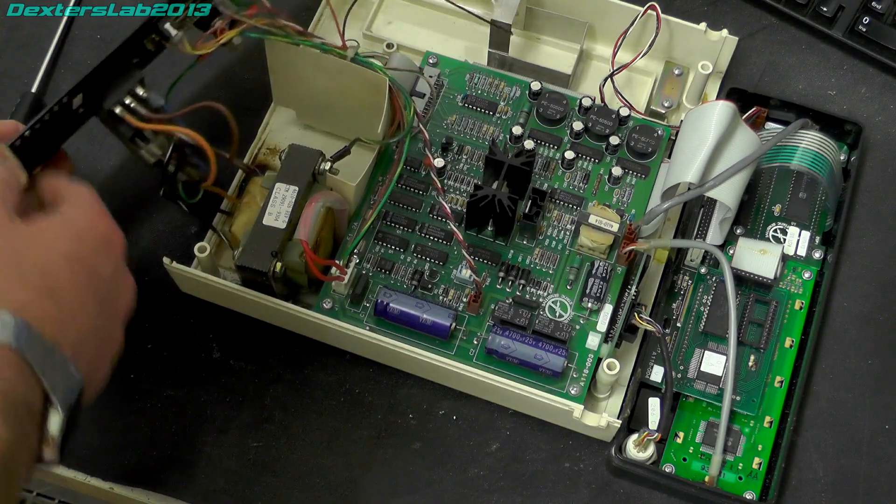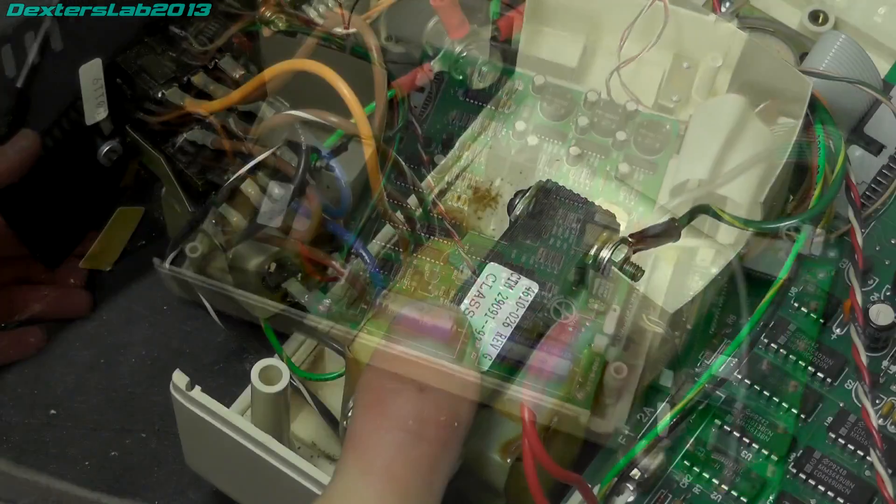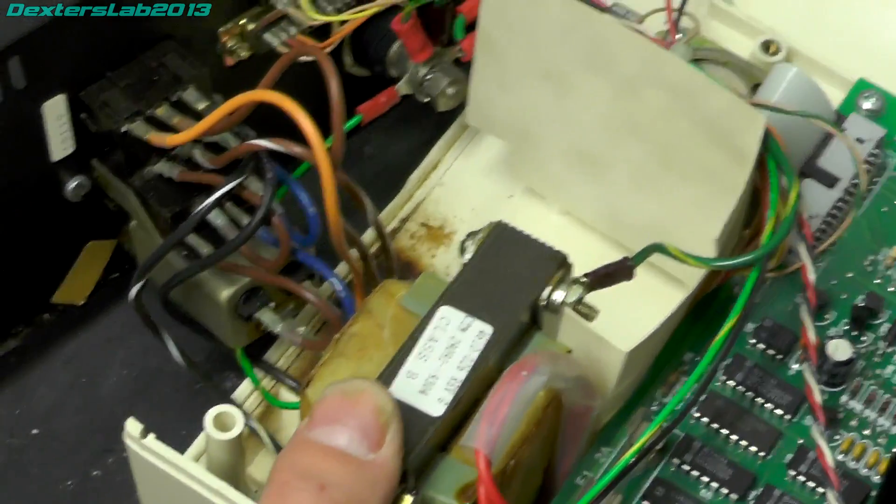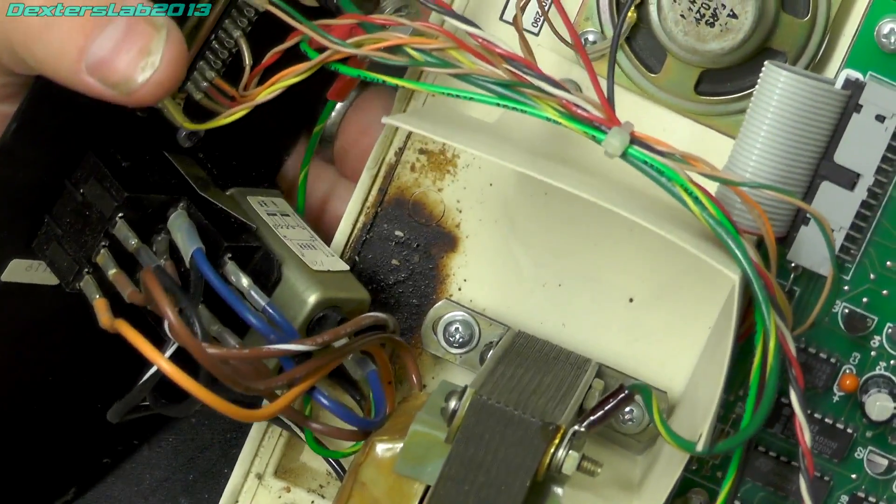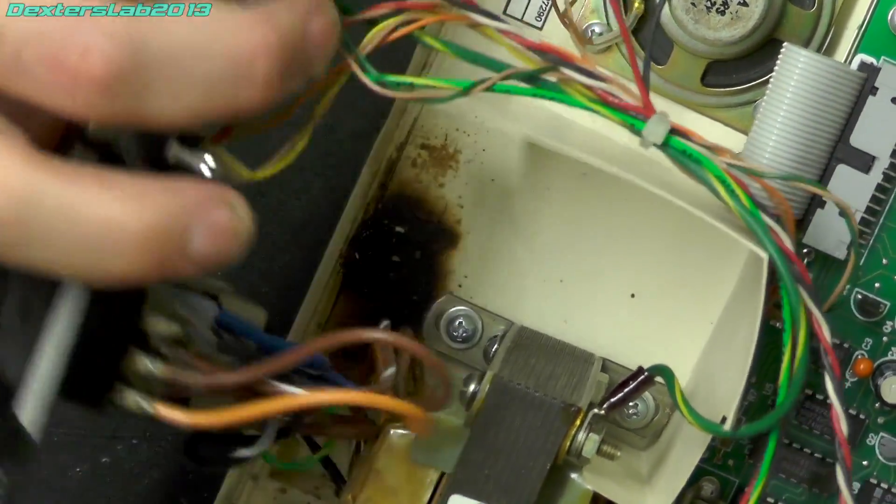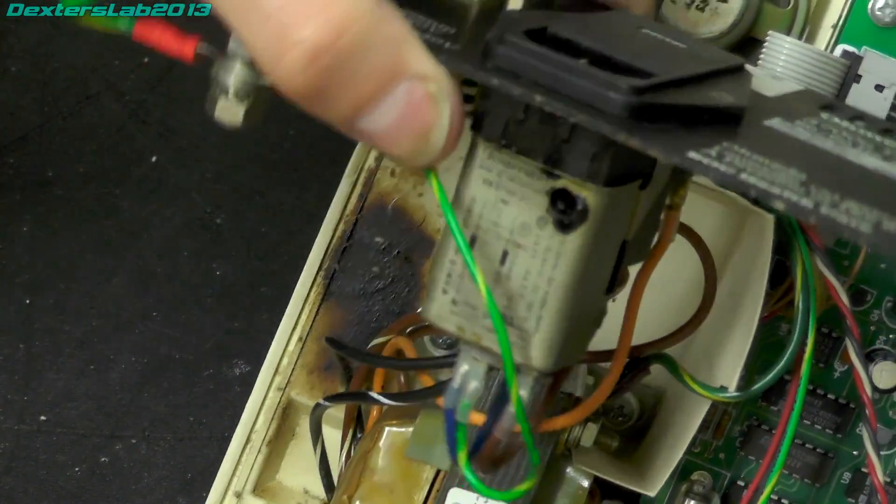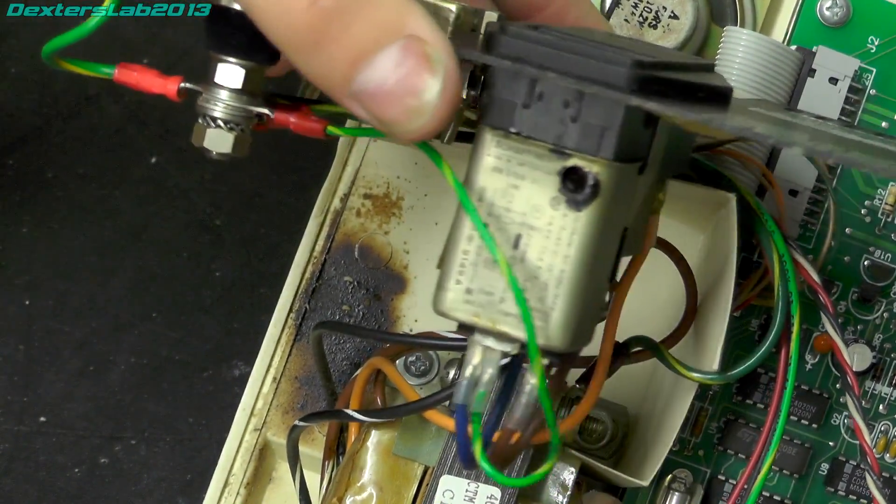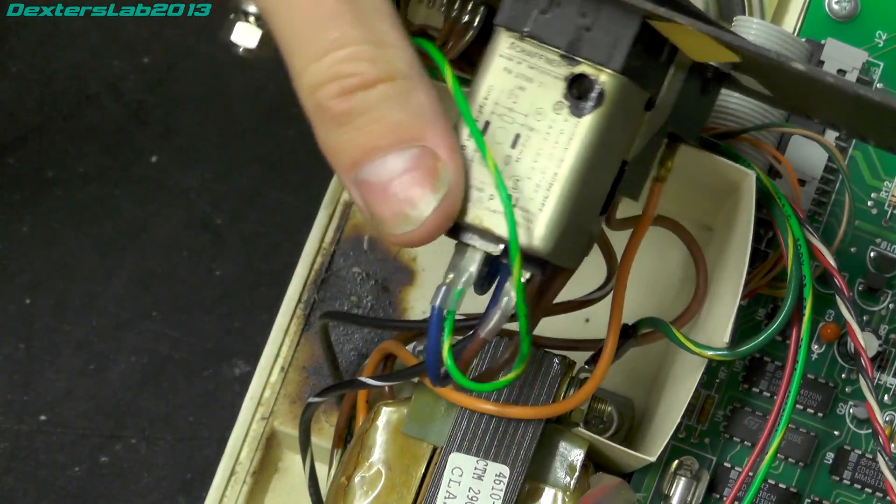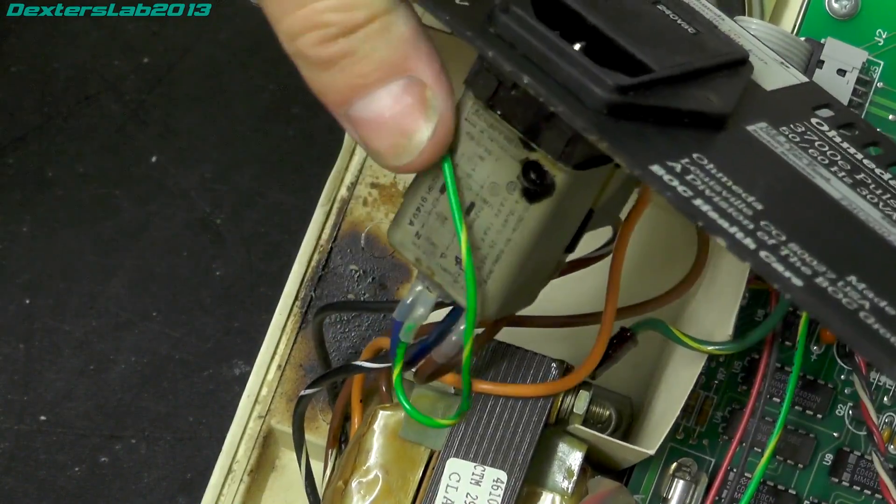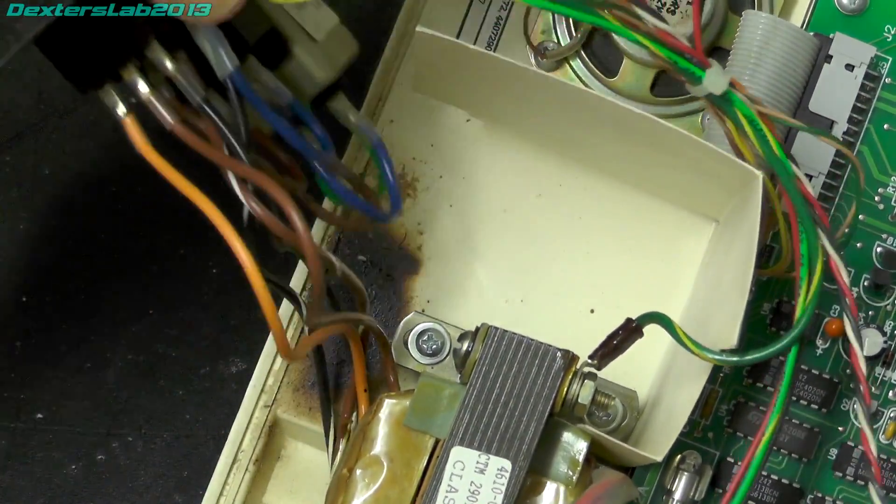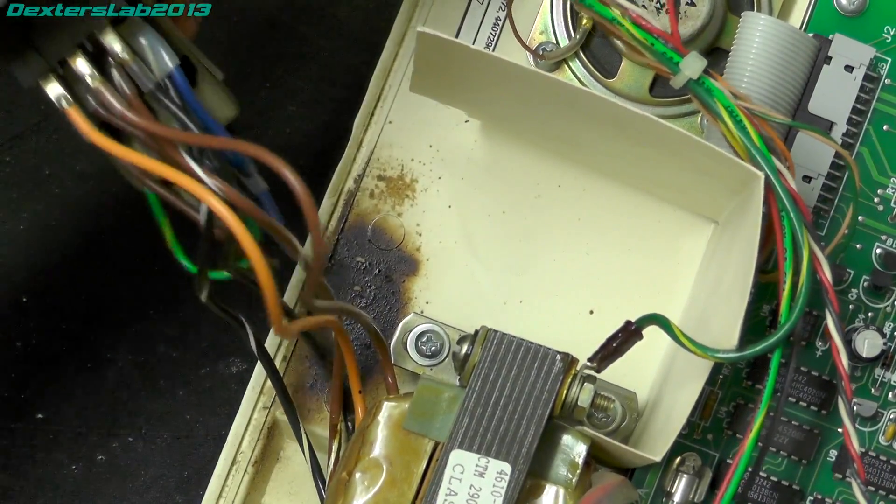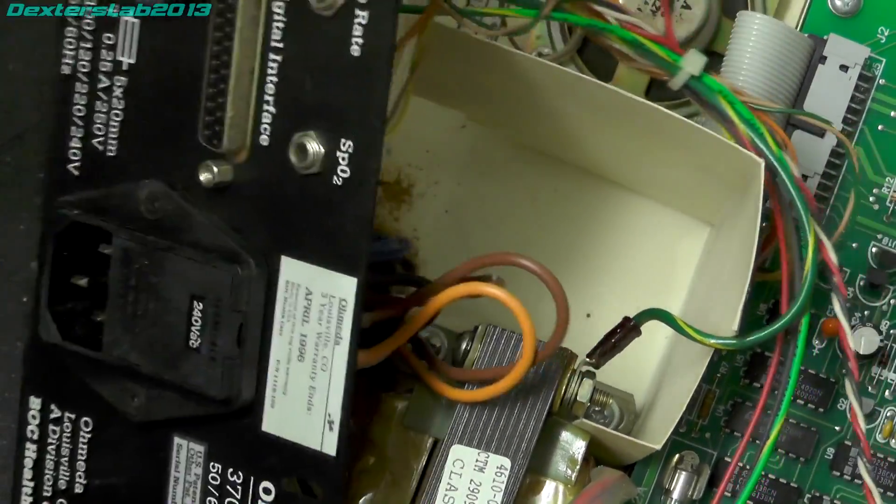Let's have a look down there. Yeah, there's a huge grubby burn mark down in the back here. Huge grubby burn mark and we have a Schaffner mains filter. So yeah, it looks like yet another failure of those Schaffner mains filters, horrible things. Yeah, so that's obviously completely thrown the toys out of the pram.